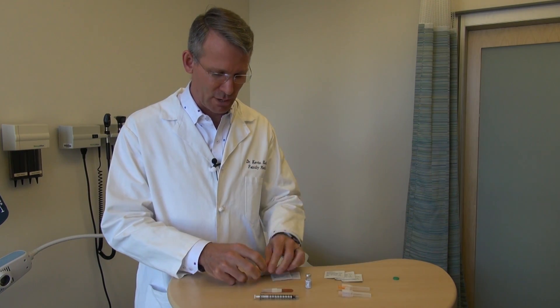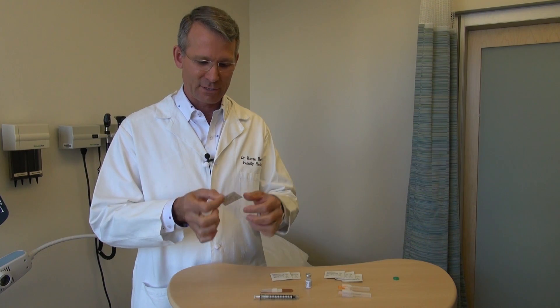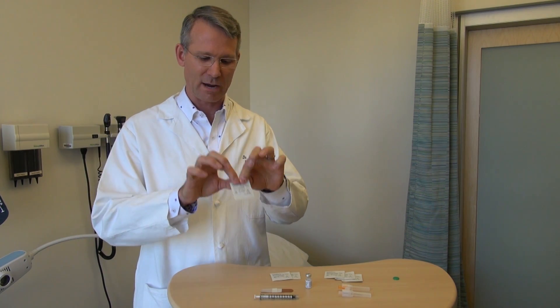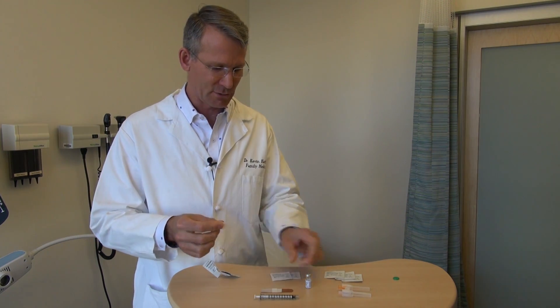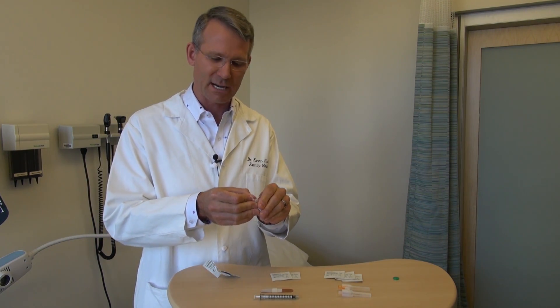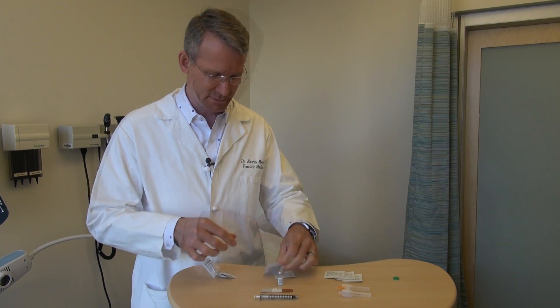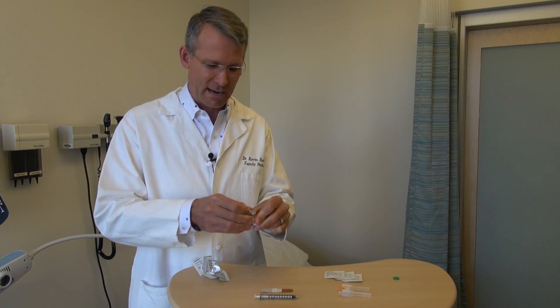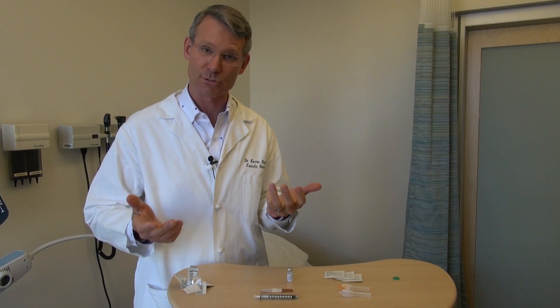Even though this is a brand new bottle, we're going to clean it three times with alcohol swabs. The easiest way to open the swab is to just grab it firmly from the edge and rip across the center. Take the first swab and make good contact with the top of that bottle, give it a good rub, and do that two more times. The bottle is now clean and the top will have a little bit of alcohol residue on it, but that'll be drying out while we're getting our syringe ready.